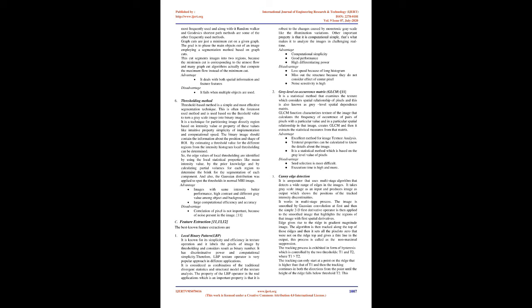4. Region growing method. Region growing technique is mostly used in implemented techniques for image segmentation. This method mainly works on prior knowledge which is used to extract the useful information in an image region. This relies on intensity details or edges within the image. This may be done by hand selecting a seed point and joining all pixels, so that all the pixels are connected from the initial seed through some predetermined criteria.